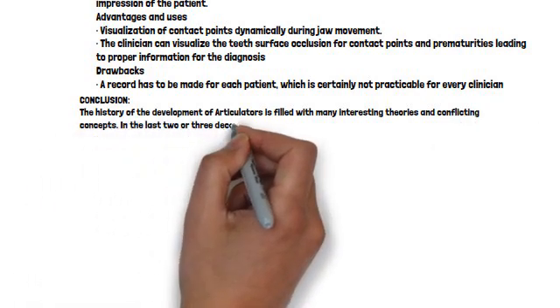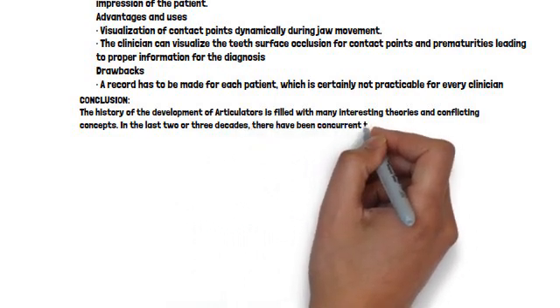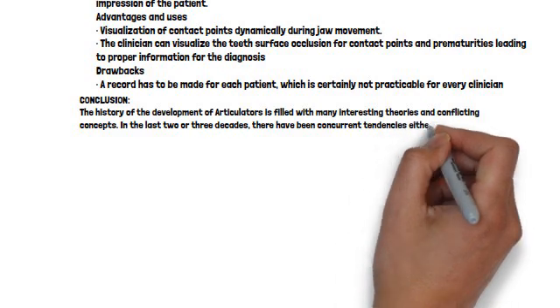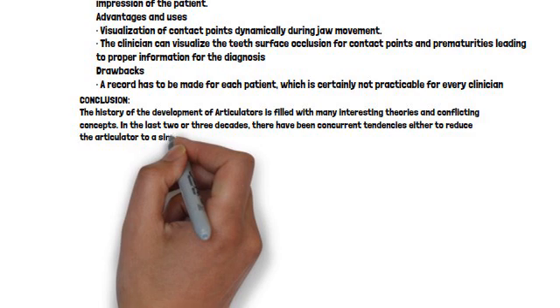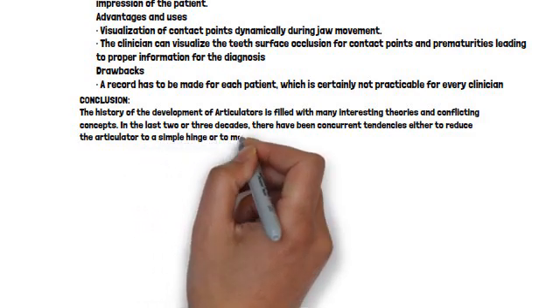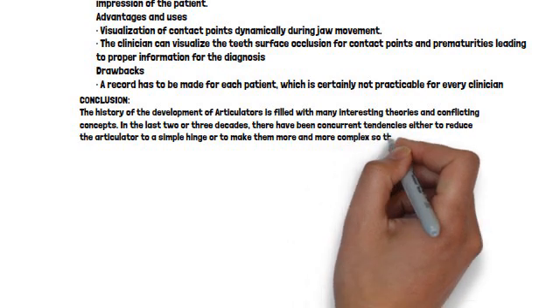The success or failure of the final restoration is more dependent on the operator of the articulator than on the articulator itself. In other words, a semi-adjustable articulator in the hands of a knowledgeable clinician may be of greater assistance in treatment than a fully adjustable articulator in the hands of an inexperienced operator.